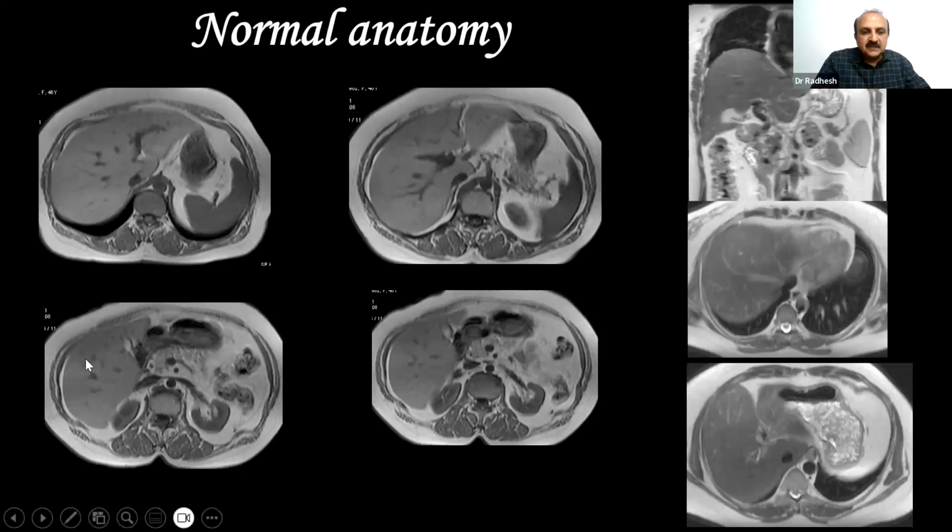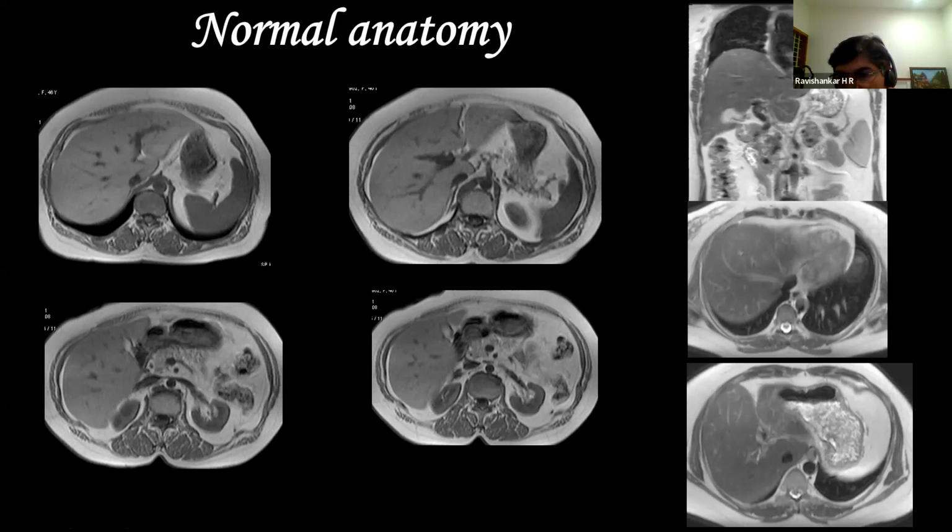But here you can use different sequences like T1, T2, and then you can use a contrast. You can use an inversion recovery sequence. You can use a diffusion weighted sequence, again, to define the involvement of the superior mesenteric vein. All these different sequences, can you just do it by programming the computer, or is there any physical activity that you need to do?